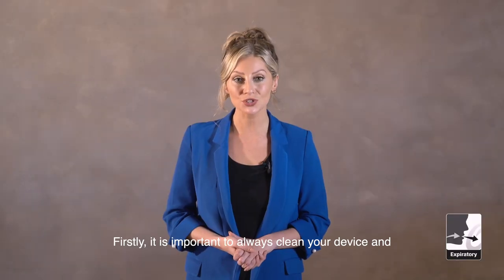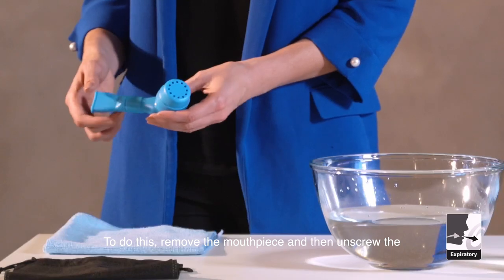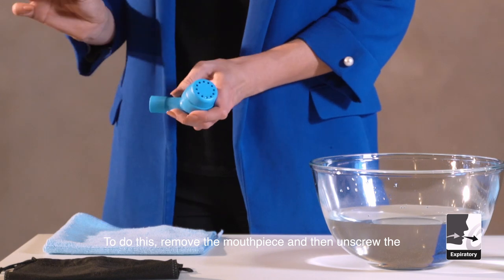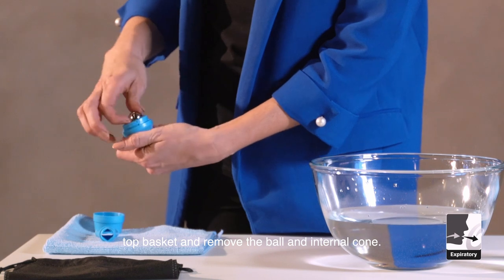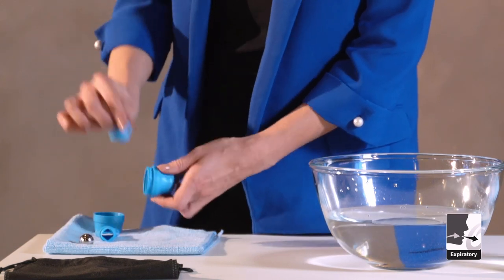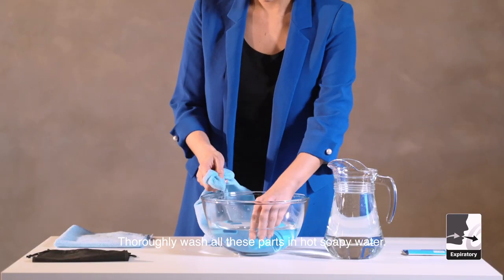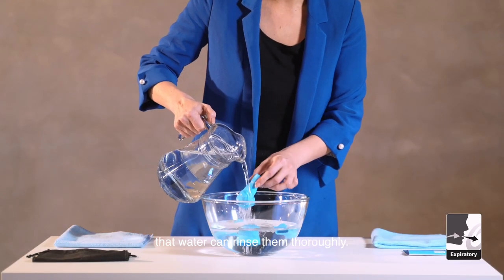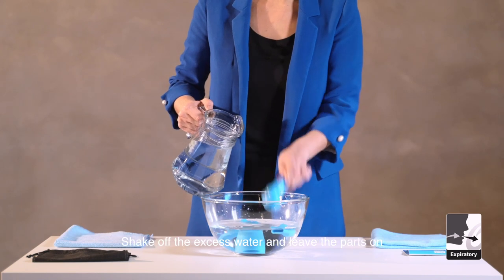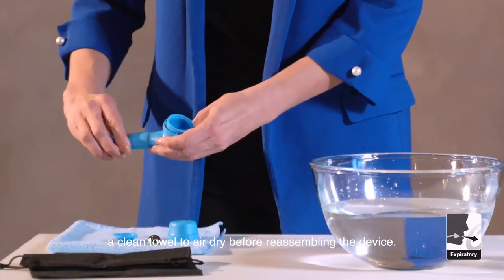Regular cleaning. It is important to always clean your device and mouthpiece after each use to prevent infection. To do this, remove the mouthpiece and then unscrew the top basket and remove the ball and internal cone. Thoroughly wash all these parts in hot soapy water. After washing, hold each part under a running tap so that water can rinse them thoroughly. Shake off the excess water and leave the parts on a clean towel to air dry before reassembling the device.